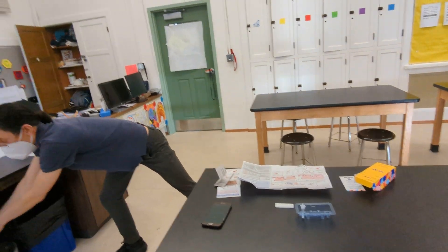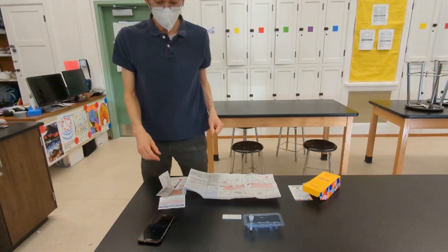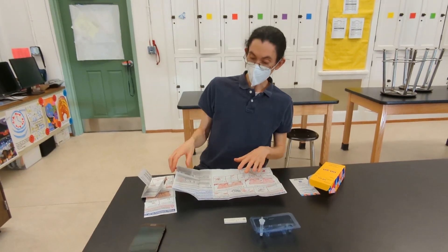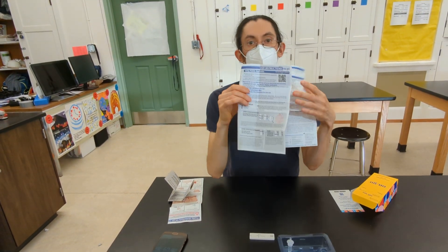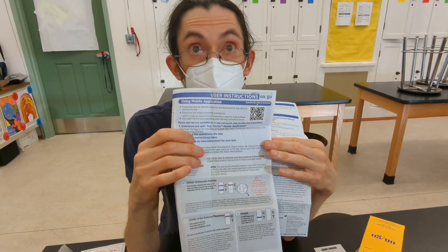And you may want to wash your hands afterwards. And that's it. You can use the, once you're done, actually, the 10 minute timer, it tells how to assess your results right here.